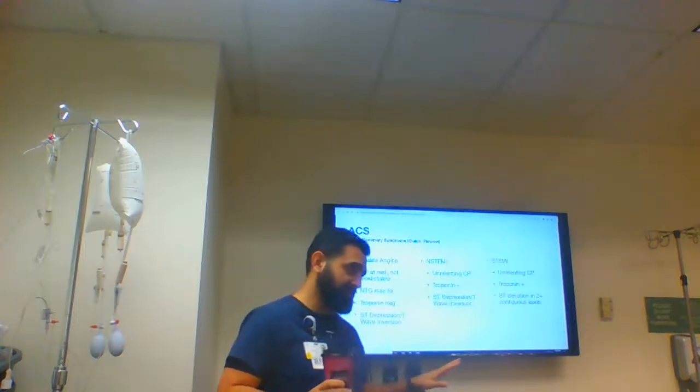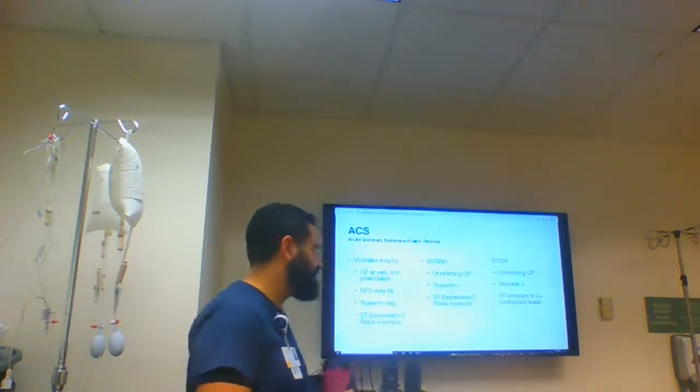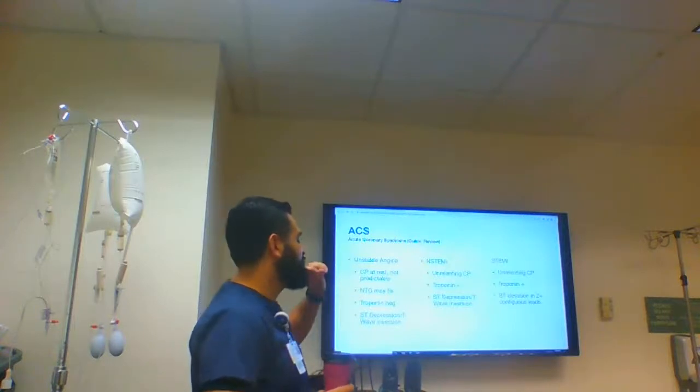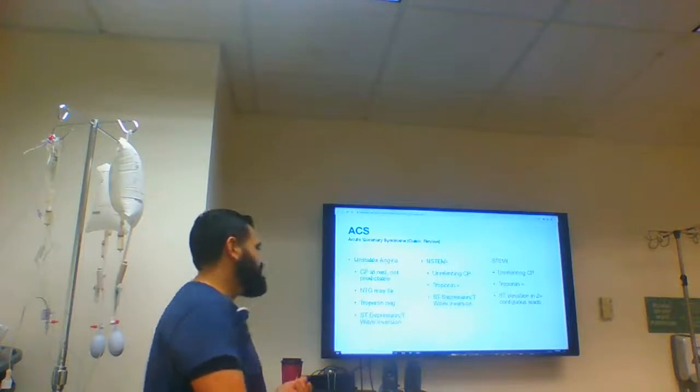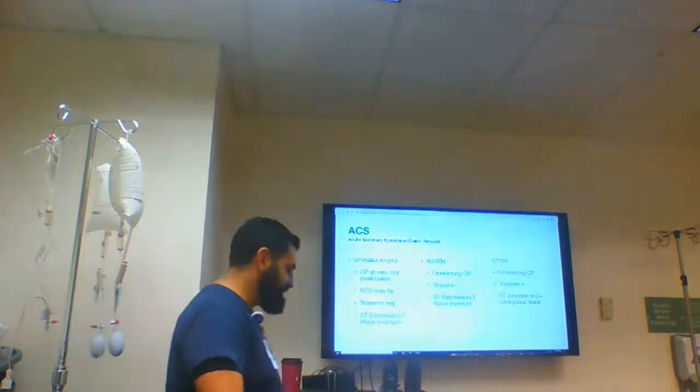If you don't recognize any other rhythm, it's absolutely important that you recognize those. And then troponin positive, of course. And then we're going to have ST elevation in 2+ contiguous leads.